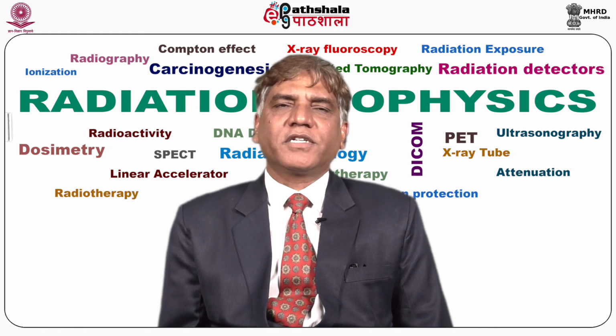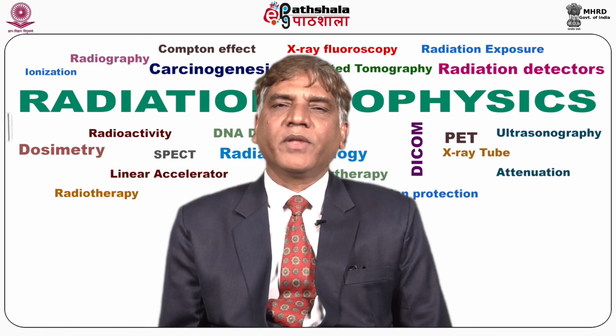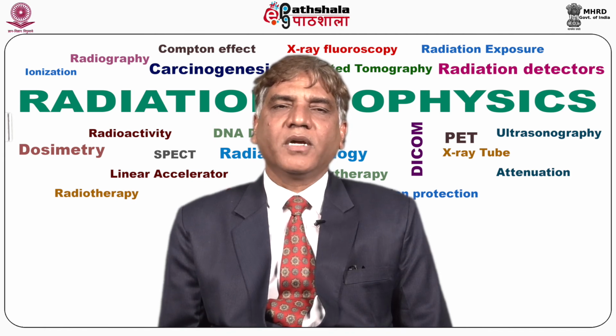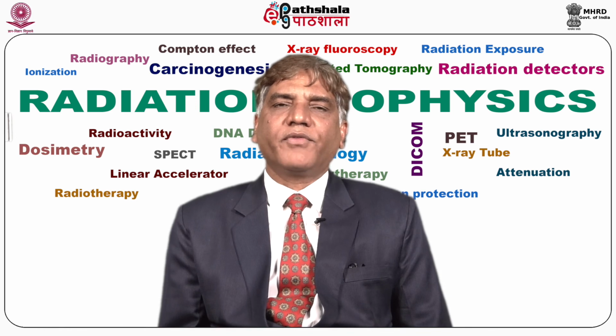Then the third generation CT scanner was introduced into the market. This was a rotate-rotate type. That means both the X-ray tube and detectors rotate around the patient body in a concentric circle whose center approximately coincides with the center of the patient. It uses a fan angle between about 42° to 49°, and detectors were perfectly aligned with the X-ray tube.